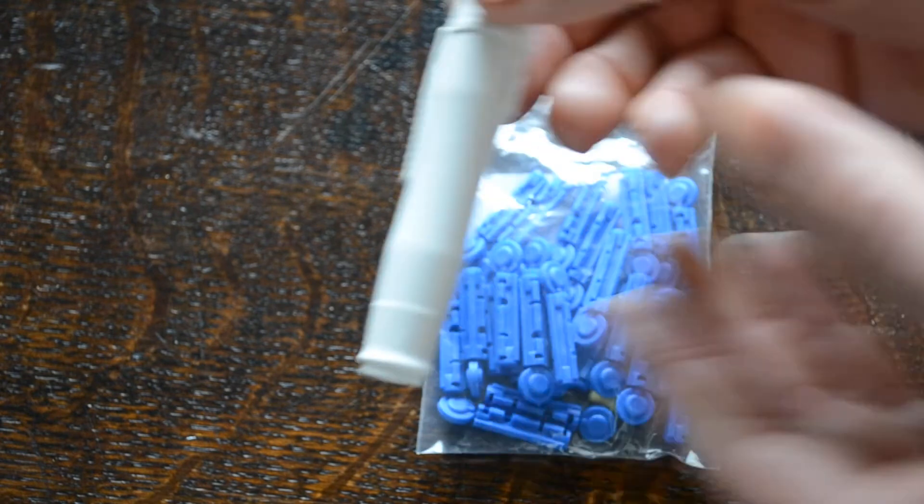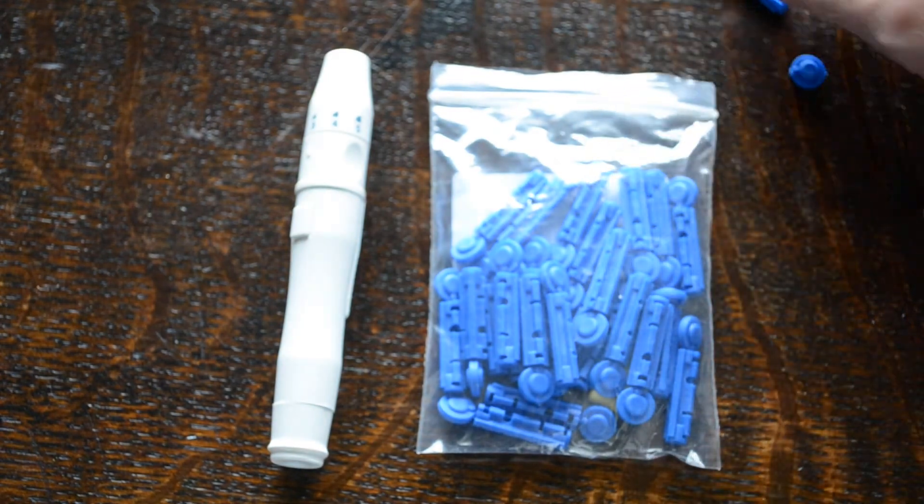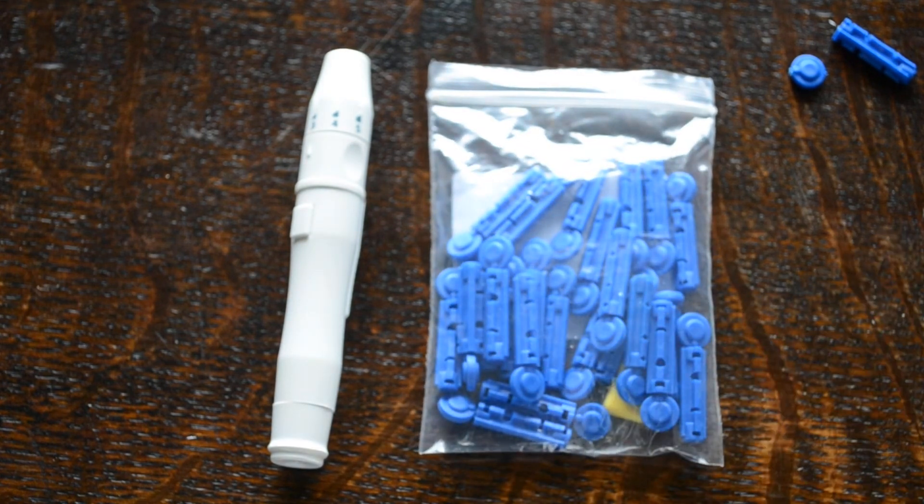Usually store them without a lancet in. If you want to store them with a lancet already in you can do so, ready to go for the next test. The lancets come in packs with the meter, but we usually recommend Mission or On-Call lancets, which are available for about five pounds for a pack of a hundred to refill these auto-lancing devices.